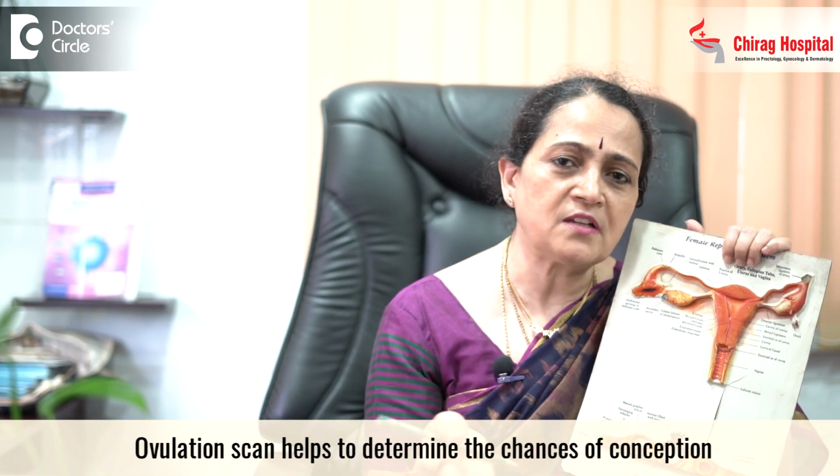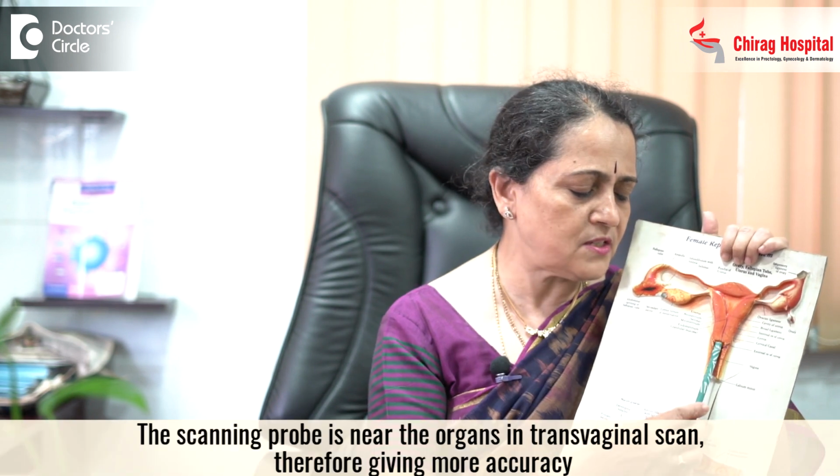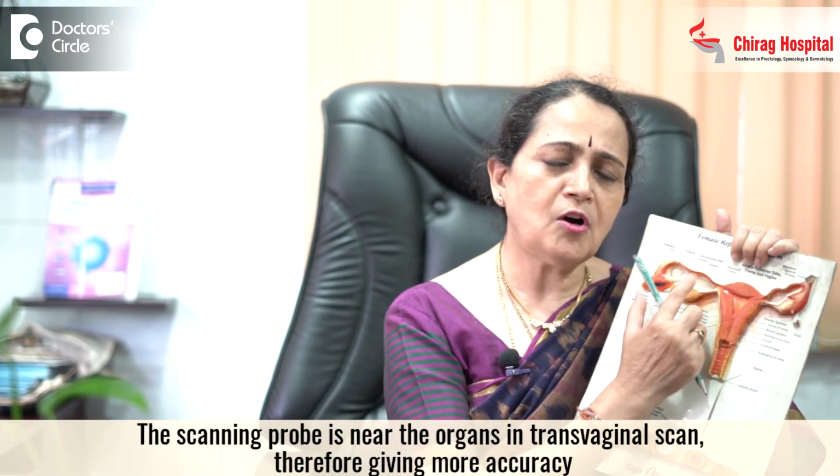This is done more in cases of early pregnancy scans and more often in the adnexal region, that is the structures that are near the uterus, for example the ovaries. See, when you are trying to conceive, at that time we do what is called an ovulation scan. Ovulation scan means seeing what is happening in the ovaries. We want to see whether the egg is growing, how healthy the ovaries are, and what problems she is having by the side of the uterus. To visualize those things, the better option is the transvaginal scan, because the probe is much nearer the organ that is being scanned.